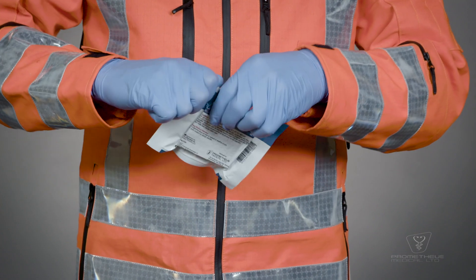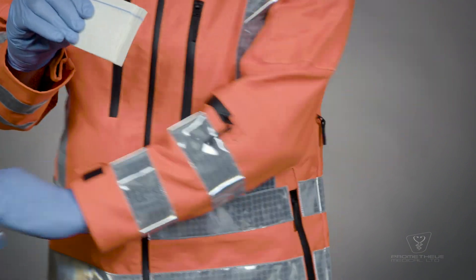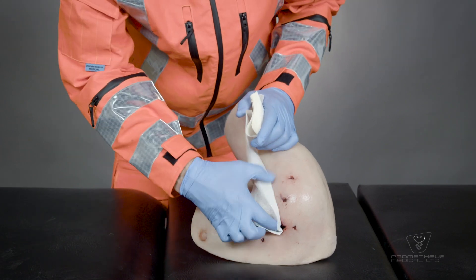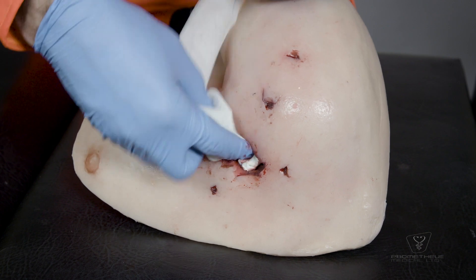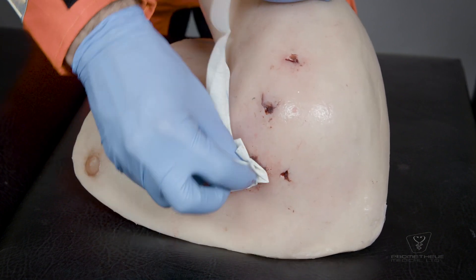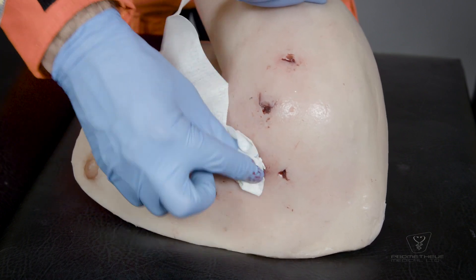Open the foil pouch and remove the ChitaGauze. Identify and cover the source of bleeding with the dressing. Pack the dressing completely into the wound track. Make sure to use enough ChitaGauze to fill the wound and contact all bleeding surfaces.